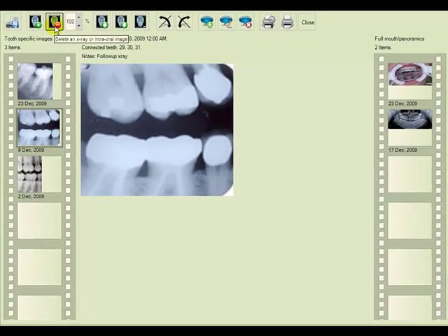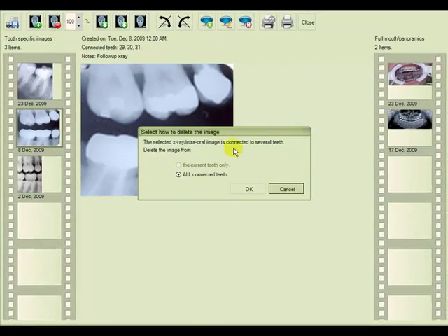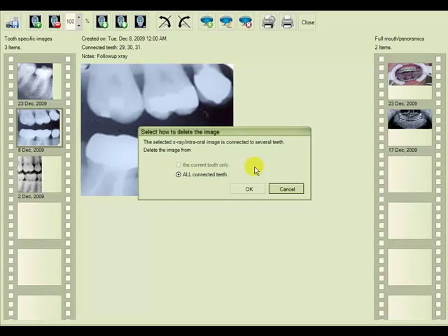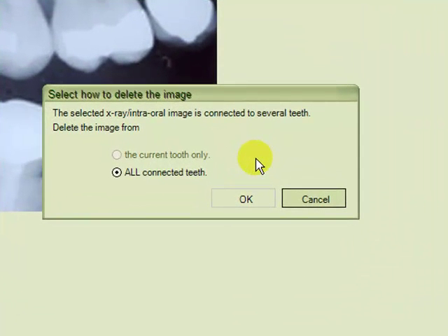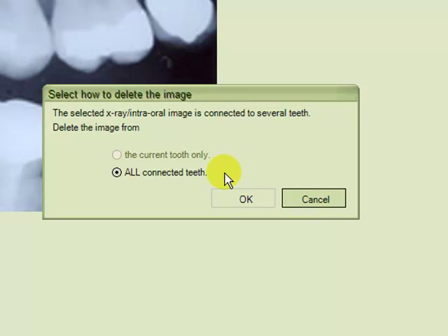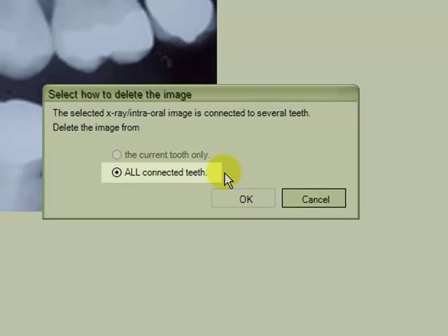From the top menu, we choose delete an X-ray or intraoral image, and we see from this view, which is view all X-rays or intraoral images, we are only given the option to delete this X-ray from all connected teeth.